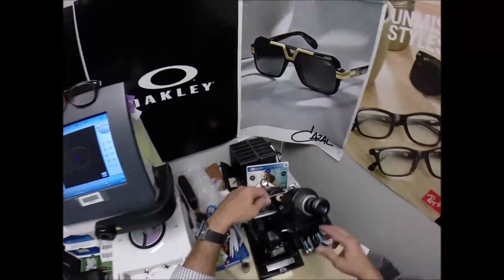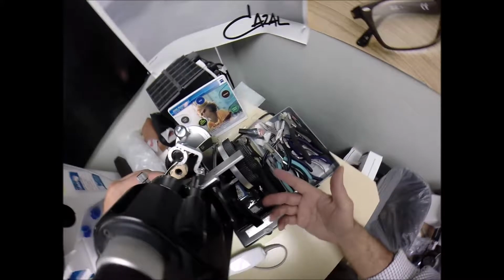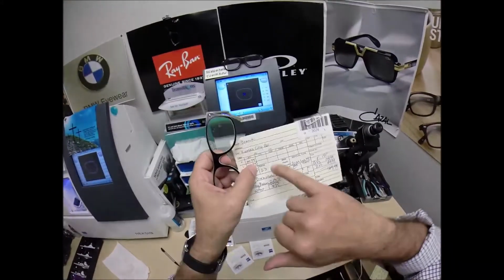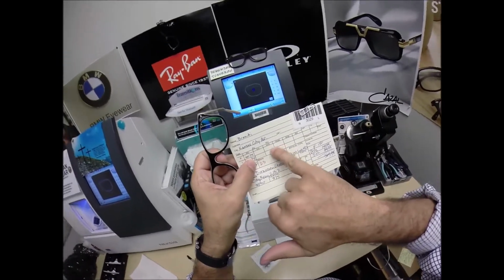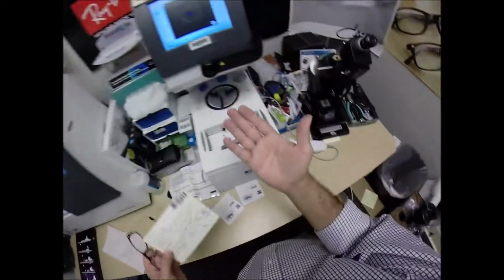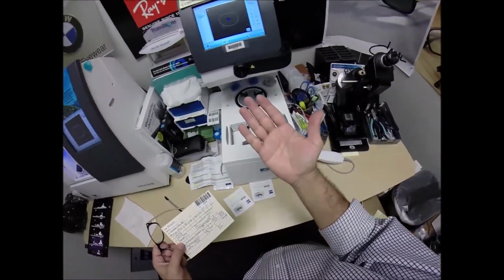Come down here, put it in over that black dot. I don't even have to turn anything. It comes into focus at 75. Same. Notice if you had astigmatism correction, that would be listed here along with the axis. But you just need these powers. Now, you could use over-the-counter reading glasses if you were going to read for hours on end.